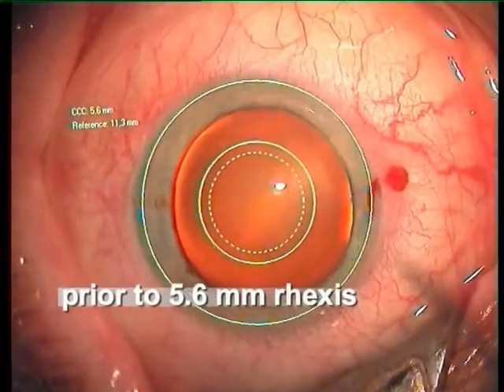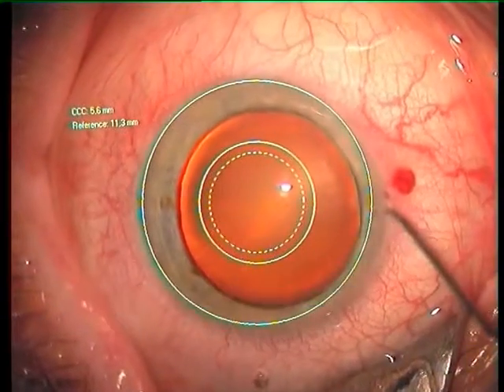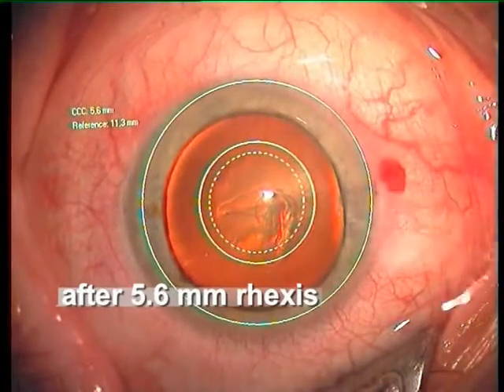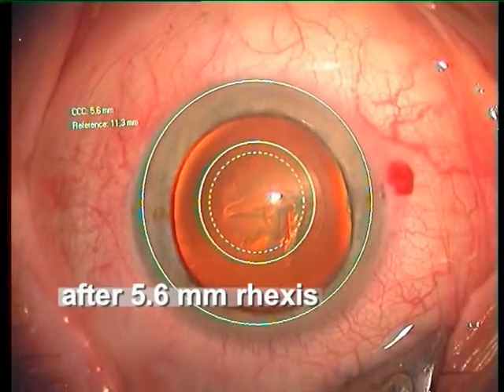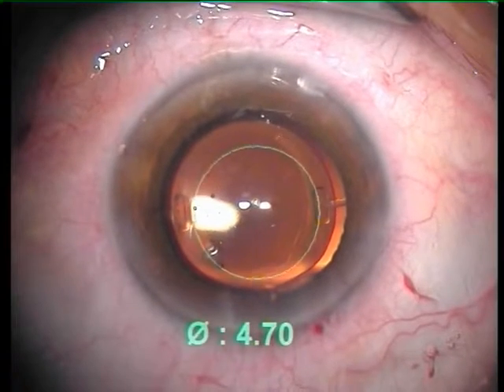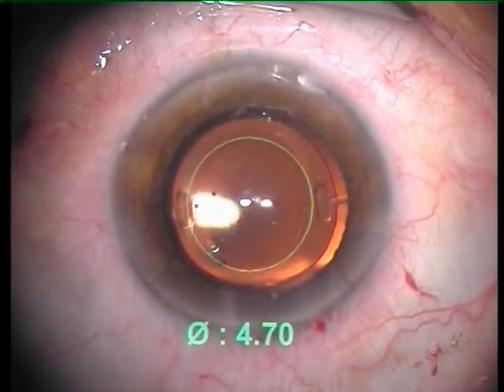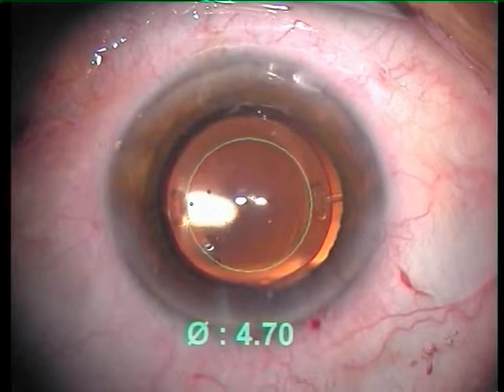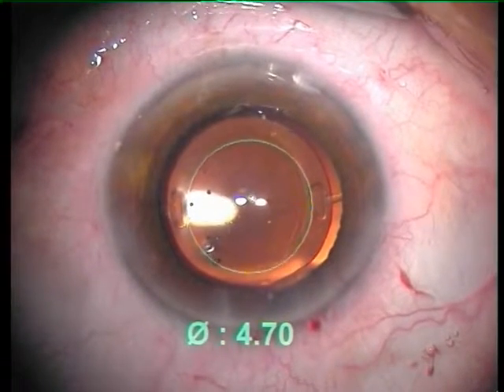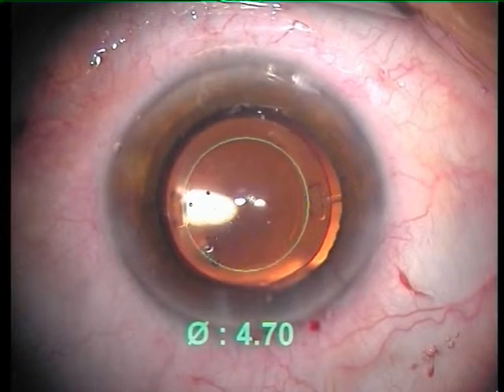The patient's eye movements, caused for example by surgical instruments, present a special challenge. These movements change the position of the reference image determined beforehand. The projected circle is moved in line with the movements of the eye by means of an eye-tracking system, and therefore adapts to the surgeon's activities during the procedure.